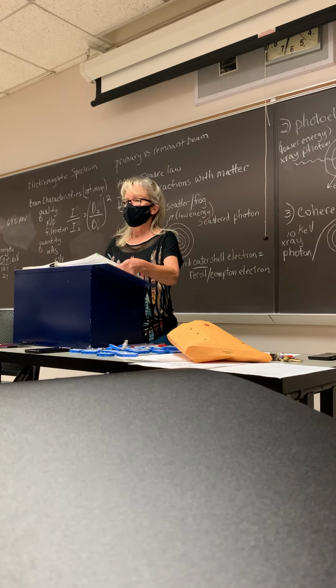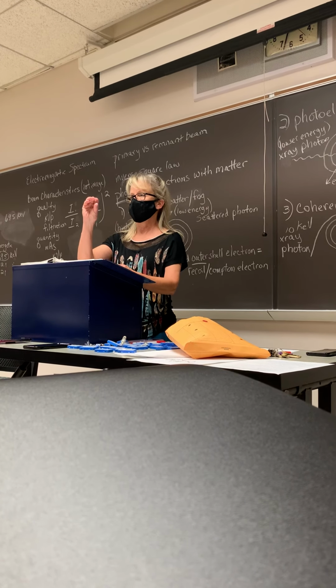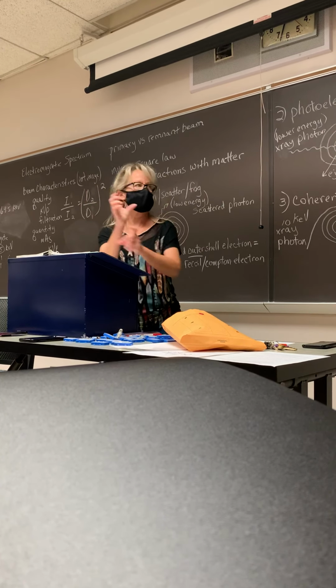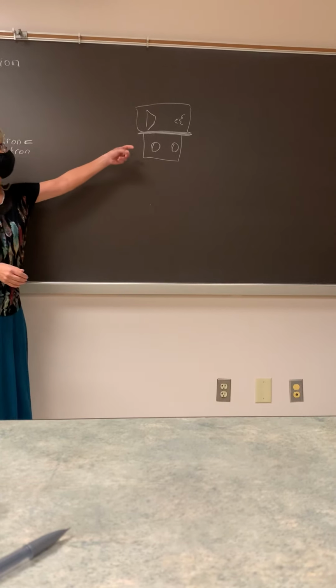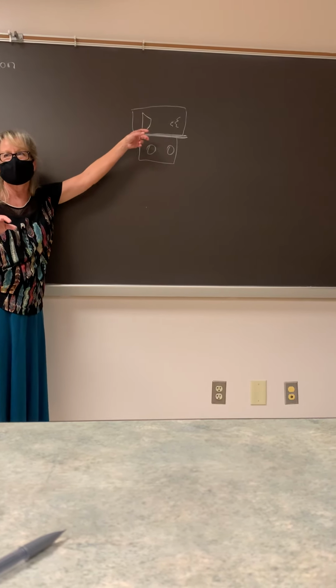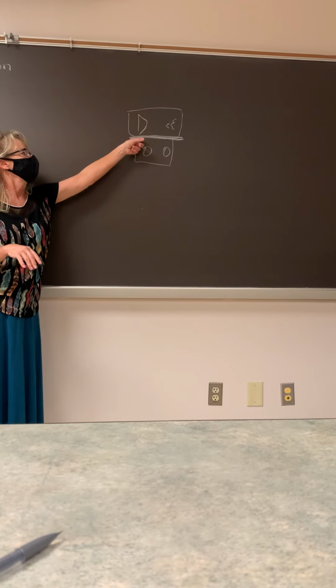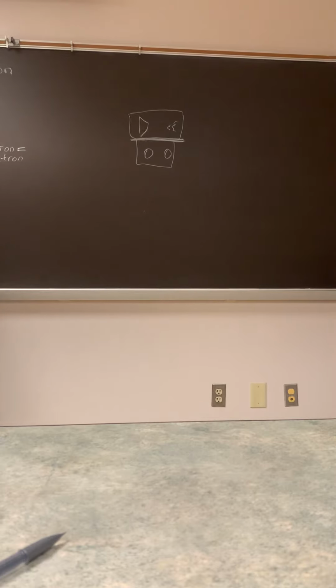Okay, you guys might have played with filtration and we have a chunk of aluminum that we just play around with and stick on, it just slides onto the collimator. Yeah, that's not what added filtration is. Added filtration is, that's why I say it's really part of the tube, and I hate how they say it's not built by the manufacturer. It really is. So anyway, all right.